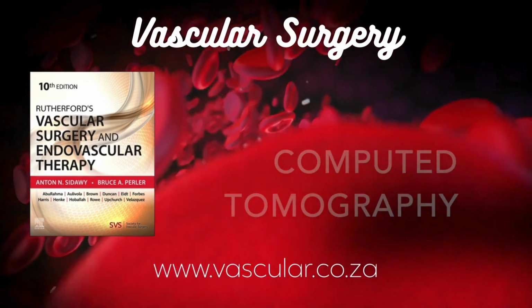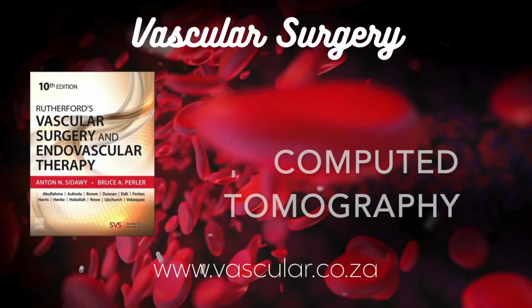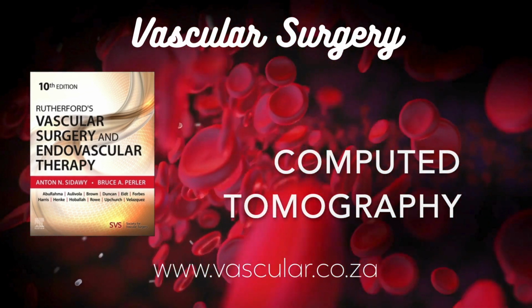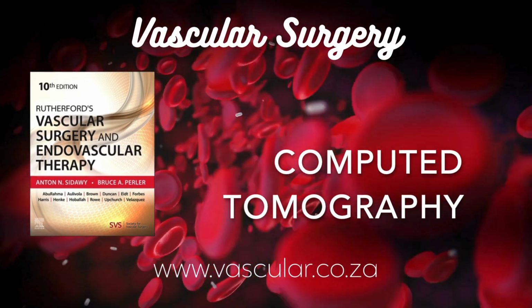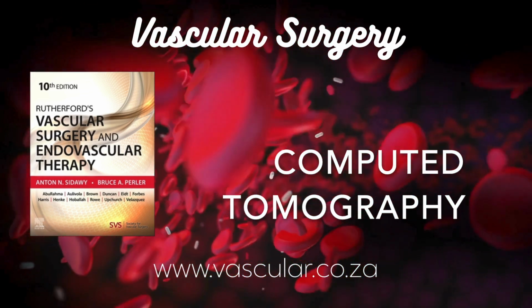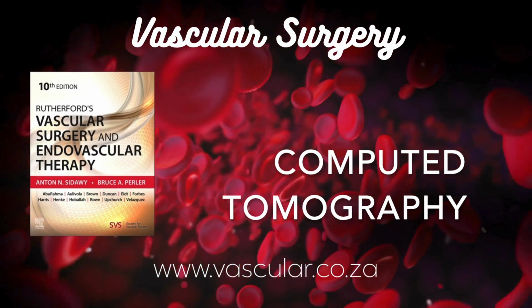What about MIP? Maximum intensity projection. MIP is different. It's usually displayed as a 2D image, but it's created by casting rays through the 3D volume and displaying only the brightest voxel encountered along each ray. So it highlights the contrast. Exactly. It's excellent for showing contrast-filled vessels, often giving a good overview, maybe in a coronal projection. It also makes calcifications very obvious because they're also high density.